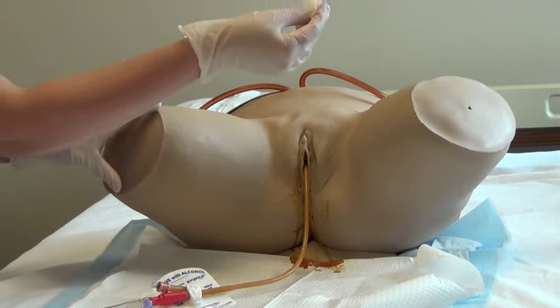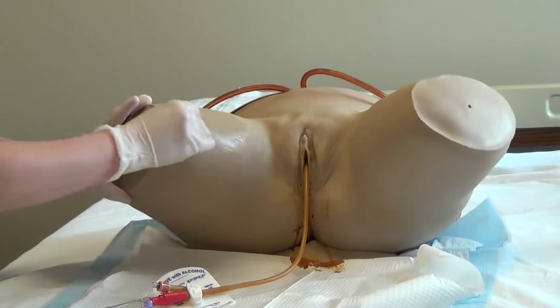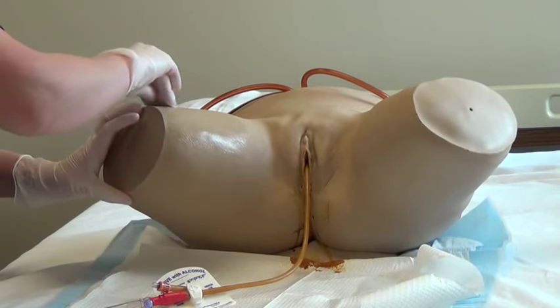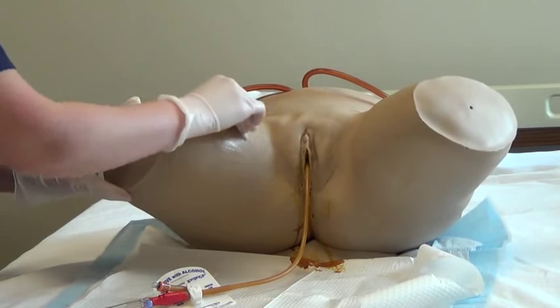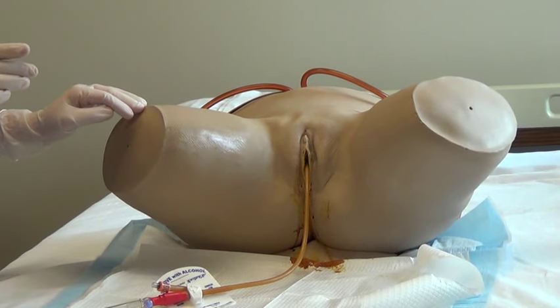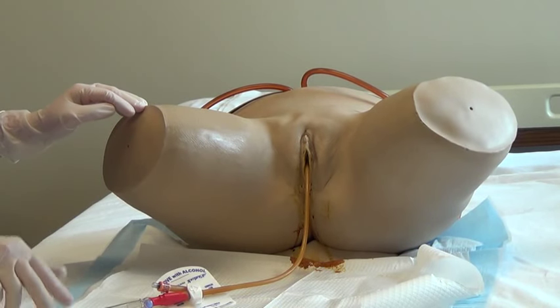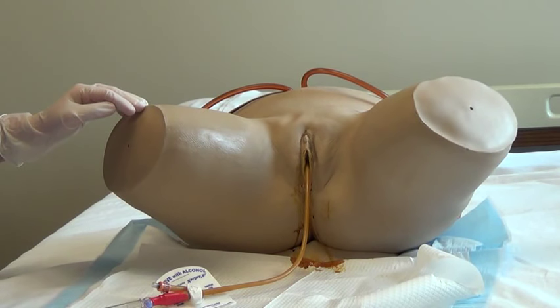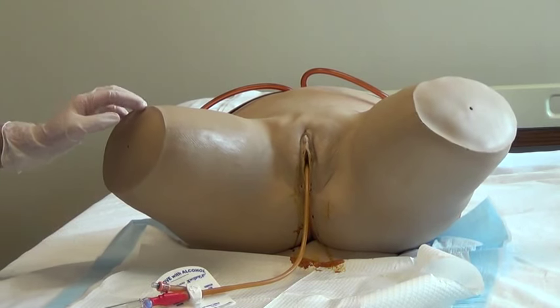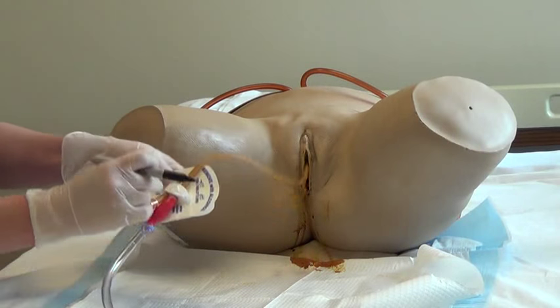Cleanse and degrease the securement site with the provided alcohol. Let the skin dry. Be sure to clean an area larger than the securement site. Apply the skin protectant using both pads in the direction of hair growth to an area larger than the securement site. Allow this to dry completely, which usually takes 10 to 15 seconds. Using a permanent marker, write your initials and the date of application on the Statlock device anchor pad.